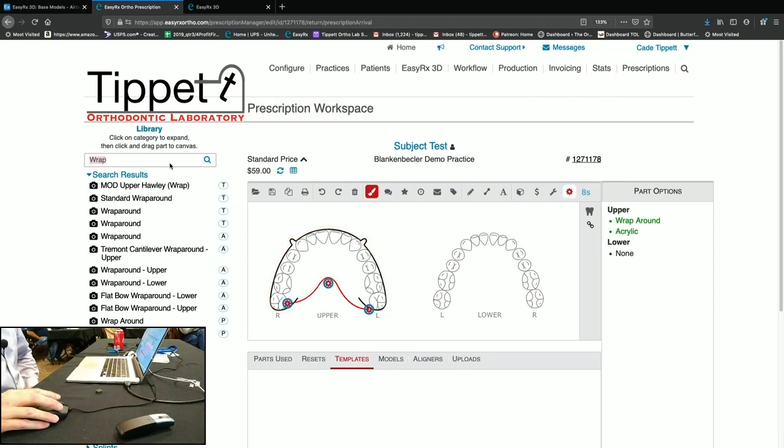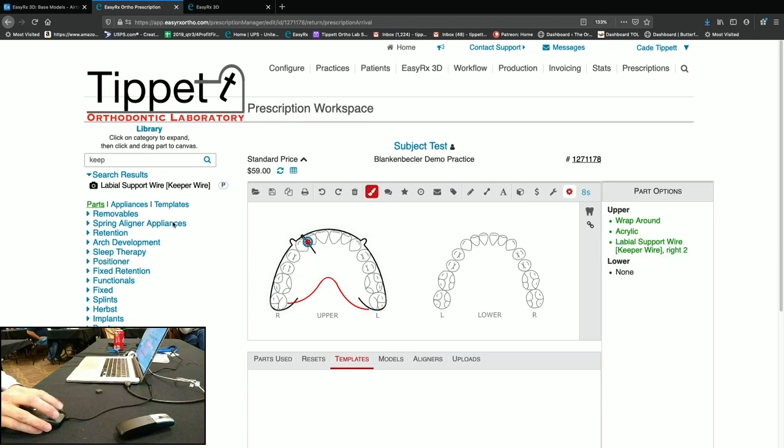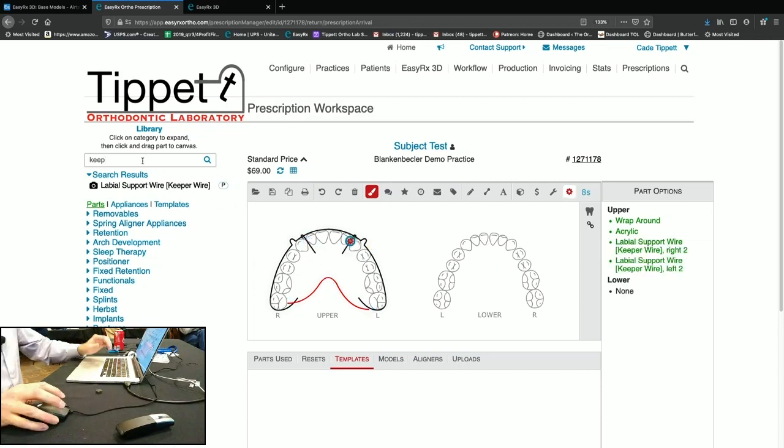If you want. So what do you call the little wires here? I know they're all called guides. I call them keepers. And it's not in here. There it is. Now, EZRX calls it labial support wire. So they use the most generic term to describe the part, so everybody can use the same part. So I'm going to drag that here and drag that here.